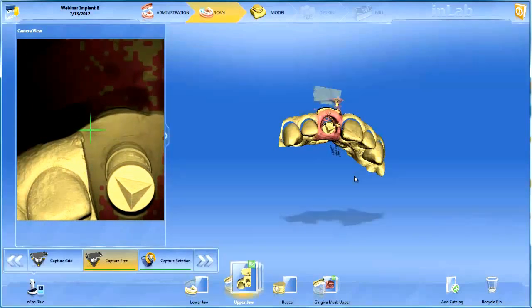As you saw there, there was an image that could not be registered. More than likely, I exceeded the 15-degree rotation. We can go in 15-degree increments as we move. Beyond that, the system has trouble stitching it together. It'll reject it. And you'll have to go back and find a good point to start scanning again.